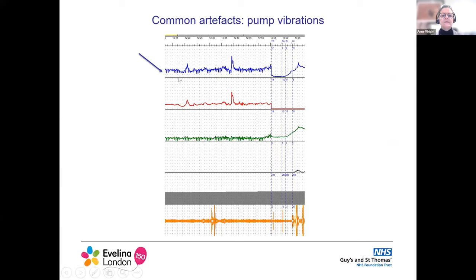Here you can see a very spiky presentation on your P-VES line and P-DET line. This is pump vibration that occurs if you're filling very rapidly — the filling line transmits to the measuring line, and it disappears when you stop filling. You can prevent this with a pump guard.